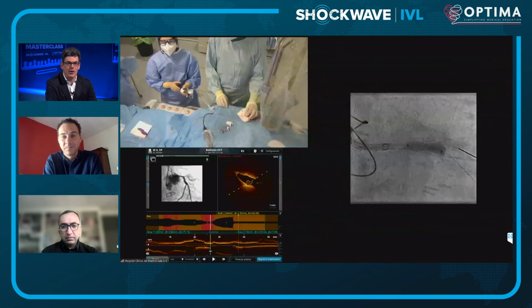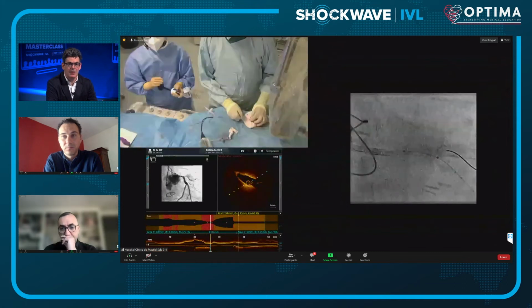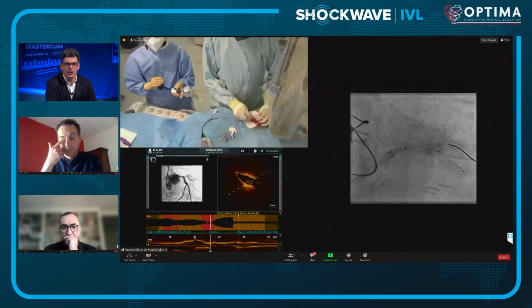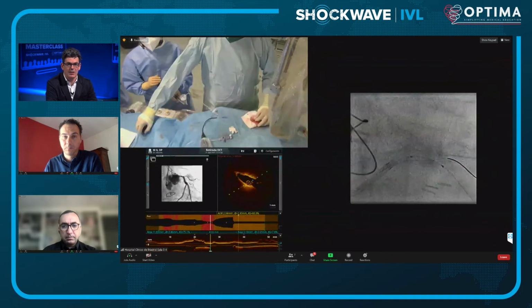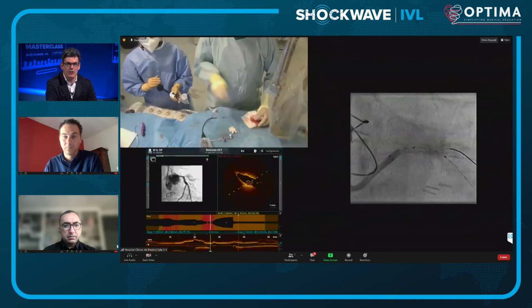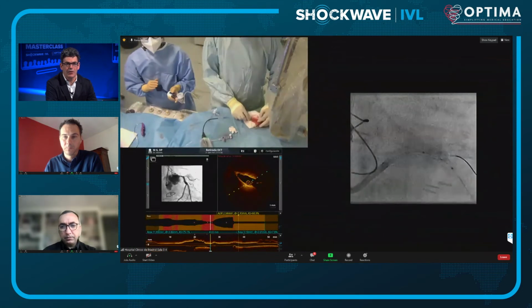Okay, so what's constraining this is the bulk of the calcium. But certainly this lumen is progressively expanding. And it may well be that at the nominal pressure of stent implantation, that degree of indentation will resolve. I would not be inclined, with this degree of expansion, to then go with a high pressure balloon. I think that's tempting fate, and you are potentially opening yourselves up to the complications of high pressure inflation, including perforation.